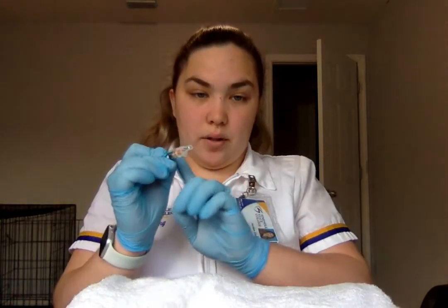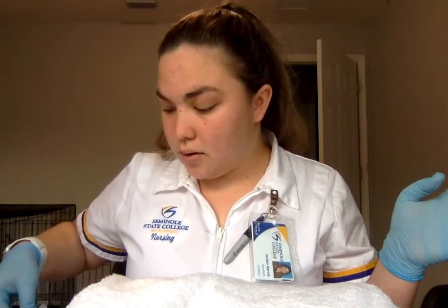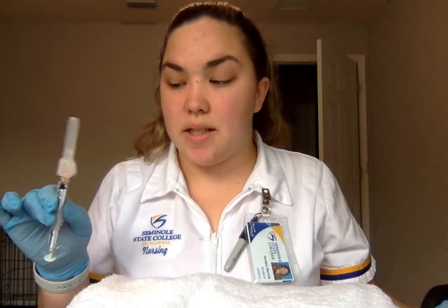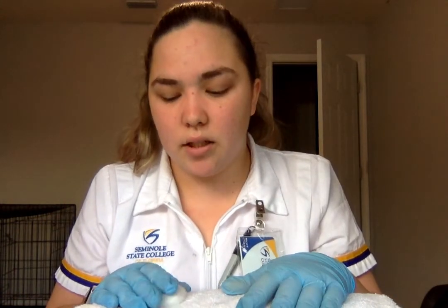And then again, I would normally engage my safety device, but because I have to reuse the needles, I'm just going to do the 1 scoop method. Okay, once I have engaged my safety device, I'm going to throw that in the sharps container as well. Now that she's had both injections done, I'm going to monitor her and make sure her injection sites, I would have her hold gauze there too, so she would have 2 gauze holdings. And then I would tape those up, band-aid them, do whatever I need to do.